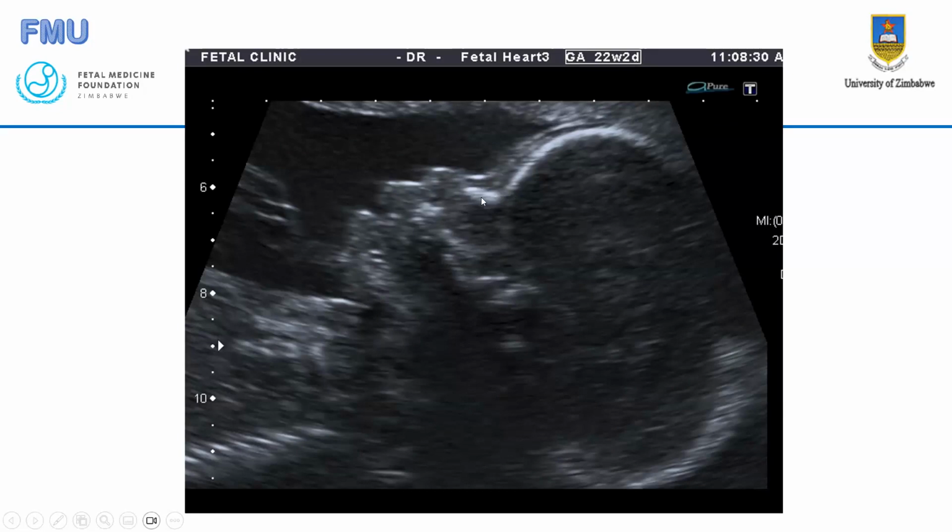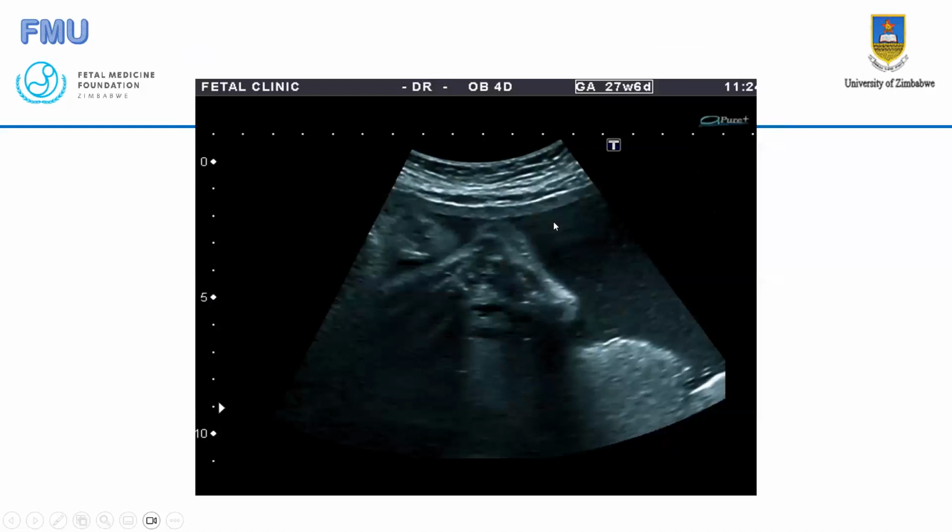Look at how it is. And there's also a depression at the nasal forehead, nasal interface there. This depression is a characteristic marker of skeletal dysplasia. We normally see this in the achondrogenesis, achondroplasia. These babies will have big heads. So that's another marker which you should look for.